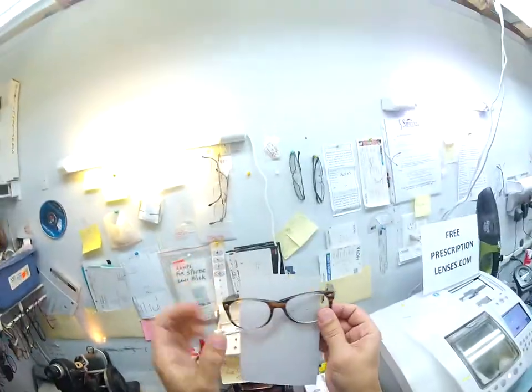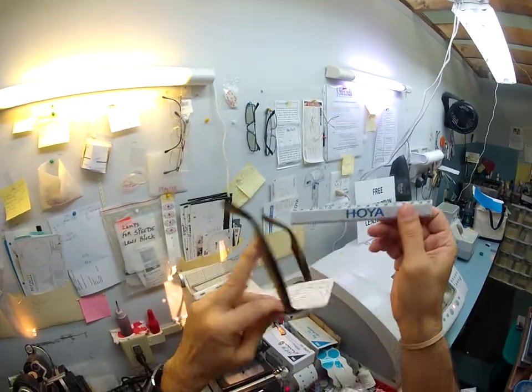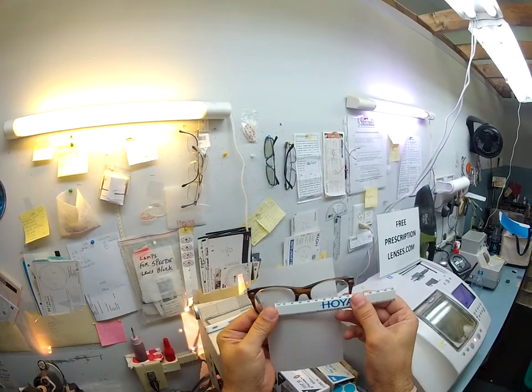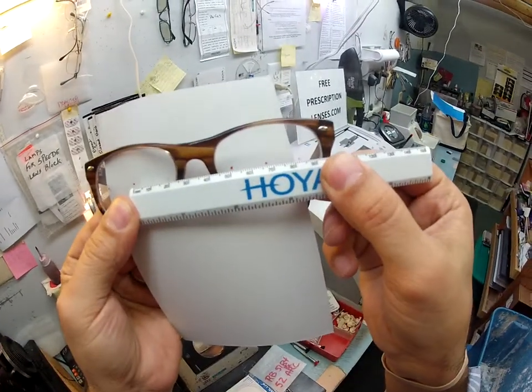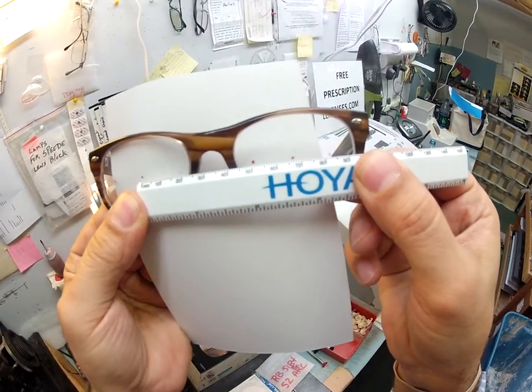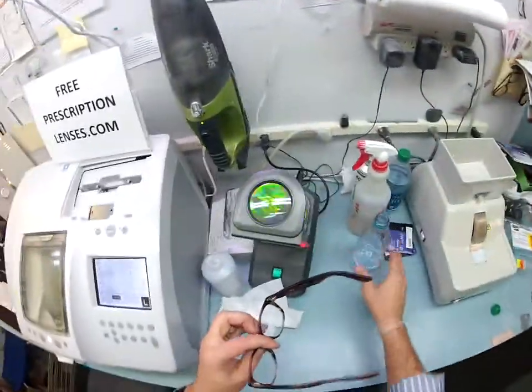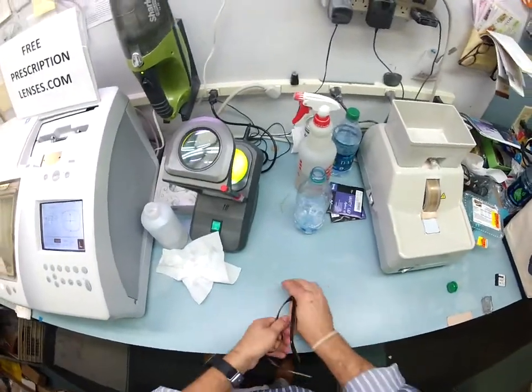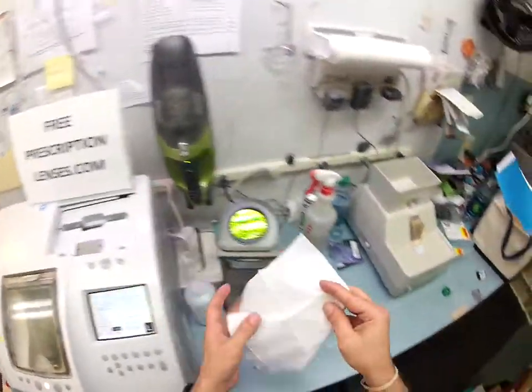Now let's check your pupillary distance of 67. When I put my PD stick up, I'm going to put the 0 on top of your right lens, even though it's on the left of the screen. We do everything backwards here. And then hopefully my GoPro camera is good enough to show you the 67 millimeters from the center of one pupil to the center of the other. So I'm going to pop these lenses out, get them cleaned up.